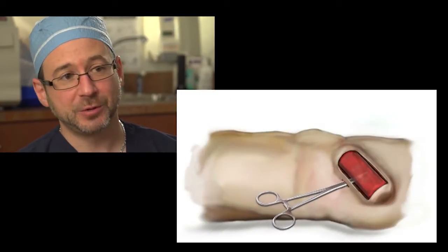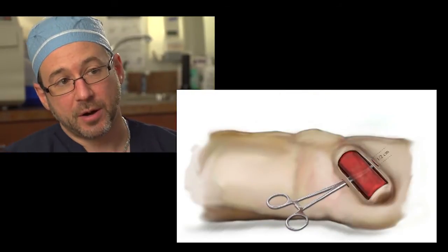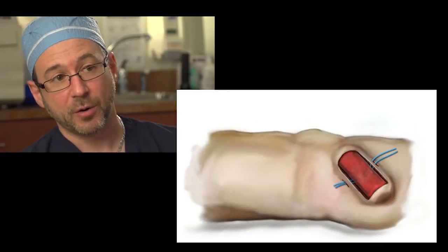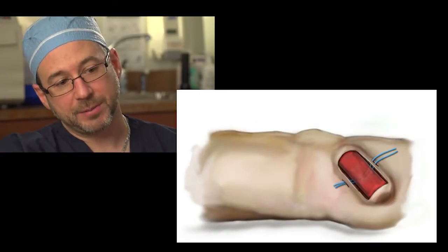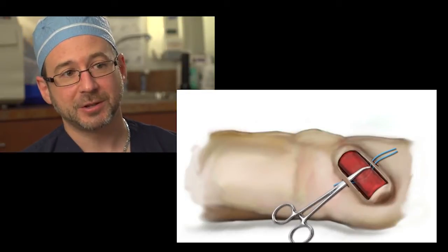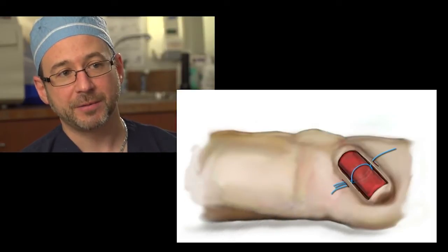The minimally invasive procedure utilizes two small incisions. The remainder of the dissection is a blunt dissection using a simple Kelly clamp to come underneath the access — under the skin and under the access until we pop through the other side, then under the skin but over the access to grab a stitch and pull it all the way around. It's a very simple, essentially medical-student-level dissection.